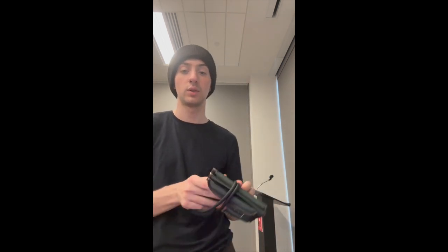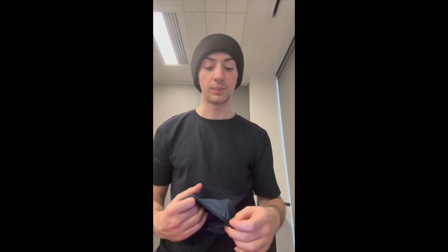But other than that, you're going to get normally between 120/80. And this machine actually didn't cost too much. It cost $20 something at Target. So if you're really interested in this, you should go buy one, because it's actually very useful. For example, I use this pretty much every day back at home when I take care of my grandpa. And it gives me blood pressure, breathing rate, I told you how to tell, temperature, or your body temperature with a thermometer, or you could use your hands and kind of figure it out. And last but not least, your pulse rate, which this tells you, and my pulse rate is 80, which is within the range as well. All right, thank you guys.